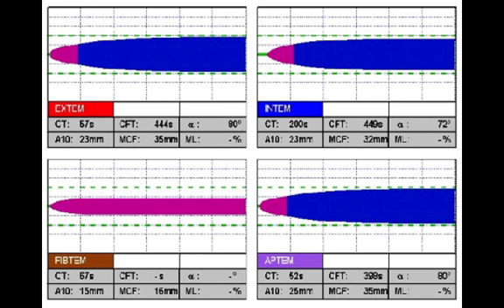So here's an example of a patient who would be platelet deficient or have dysfunctional platelets. As you can see, we talked a little bit earlier about that alpha angle, and you can see just how long these graphs are stretched out and just how much that alpha angle is blunted. So this is a patient that would have some type of platelet dysfunction or just be flat out low on platelets. And then one of the ways that we use this to determine whether it's platelet dysfunction or fibrinogen that's causing the problem with the low alpha angle, because either of those can cause it.